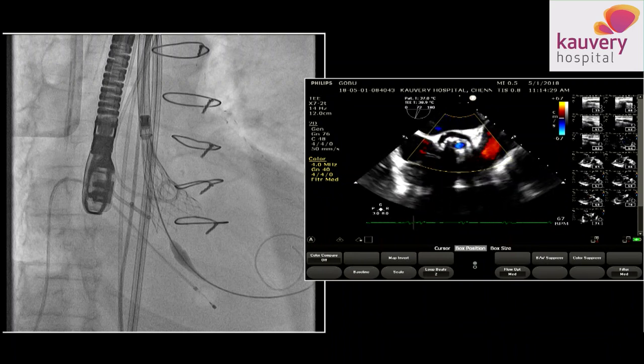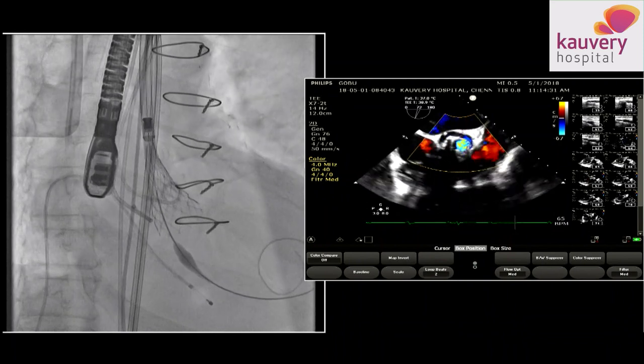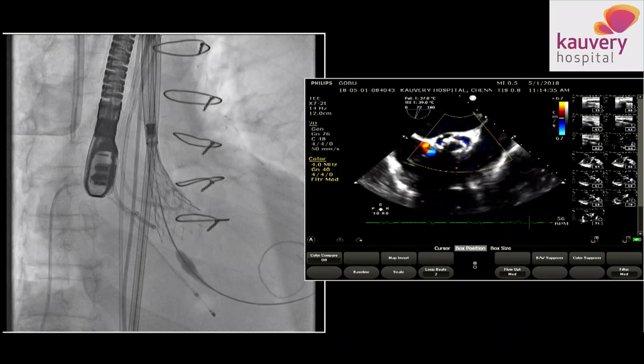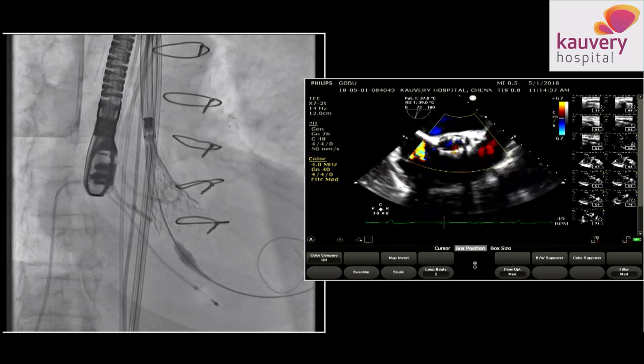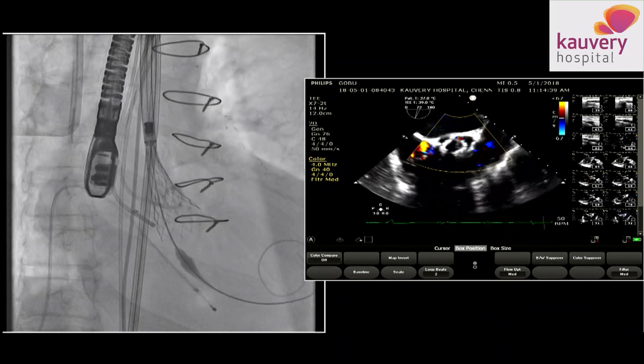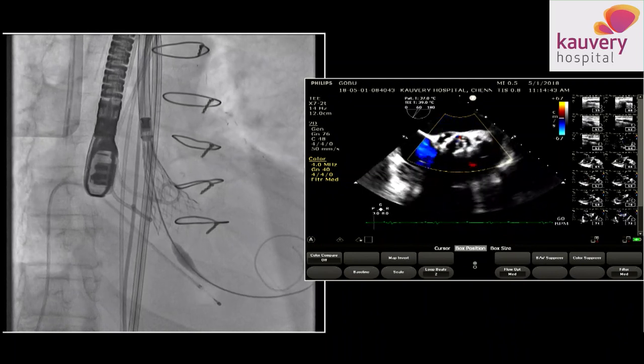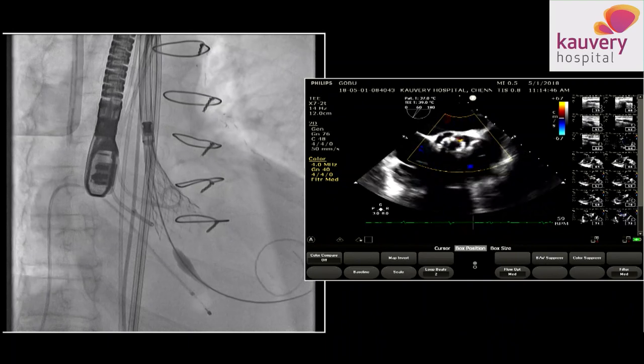Okay. Looks good. I'm happy to release it here. I think our endpoints are pretty good here because I agree it's a bit low down and the pressures are very good. But I think it's acceptable. And even now the diastolic is 90, so we can't be having much AR. Yeah. And I'm happy to release it here.